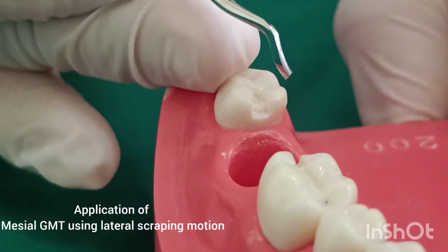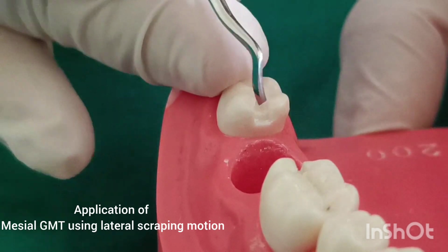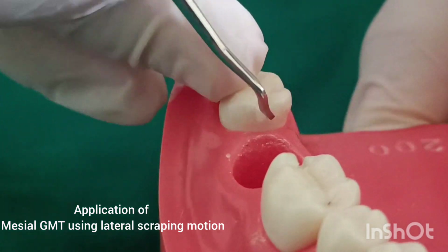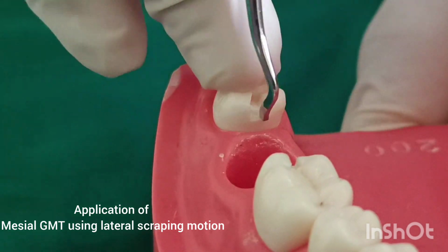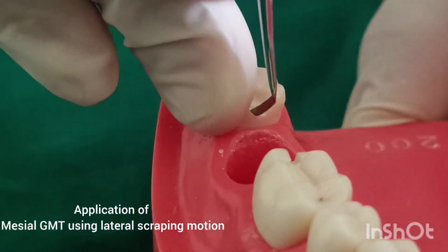This is a mesial cavity. We use a mesial GMT to bevel the gingival cavosurface margin. Insert the instrument into the cavity and use a lateral scraping motion to bevel the gingival cavosurface margin. To bevel it on the other side, flip the instrument and use a lateral scraping motion.